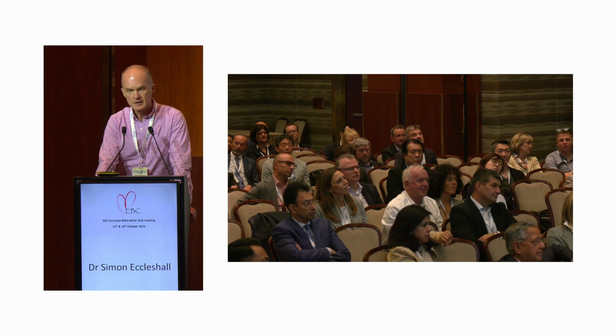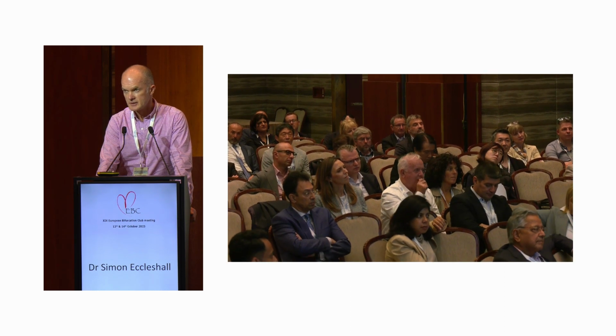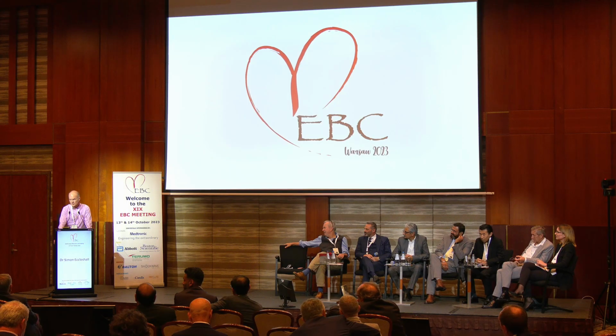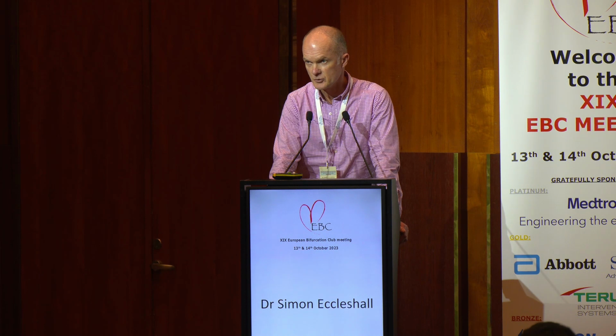I know Antonio is very keen on using physiology, particularly to predict dissections that can't be left. Anecdotally, I've seen a few. Generally, we don't actually work on the pressure wire for our DCB angioplasty because we're not good enough operators and the wires don't behave very well in our hands. So we use pressure wire a lot to decide if we're going to fix, but then we work on a normal wire. So I don't have much of my own experience of it. Generally, if we do have it in and we're looking to see a result, to my mind, all you need to do if you're doing DCB-only angioplasty is turn a vessel that is ischemic with whatever parameter you're using to non-ischemic, and then you rely on the late lumen gain as long as it's a safe result.